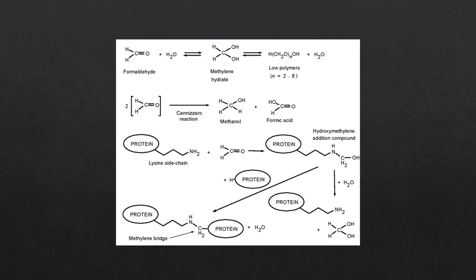Now we have covered two specific portions of pre-IHC protocol, producing the antibodies and choosing the right antibodies for the job. We'll now start talking about a generalized IHC procedure. Let us begin with a discussion of formalin fixation and paraffin embedding. Remember that we embed tissue samples in paraffin so that we can properly cut the tissue.